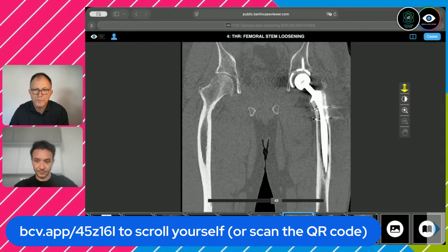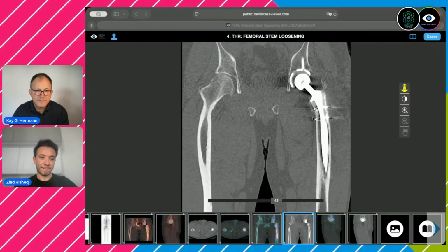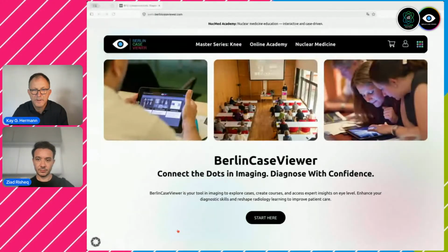Okay, cool. So this is very nice. We have seen 3 great cases. Of course, when experts are demonstrating, this is quite a wealth of information. So if radiologists who are not trained with nuclear medicine methods are looking, they just see the pattern, the activity, but you explained very nicely the different things that can be done.